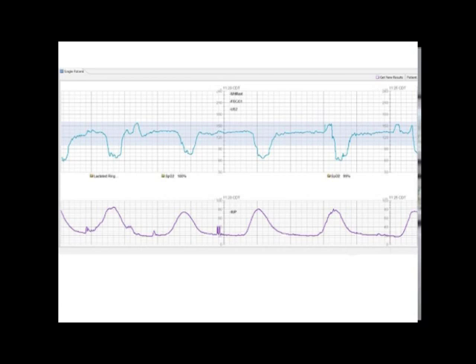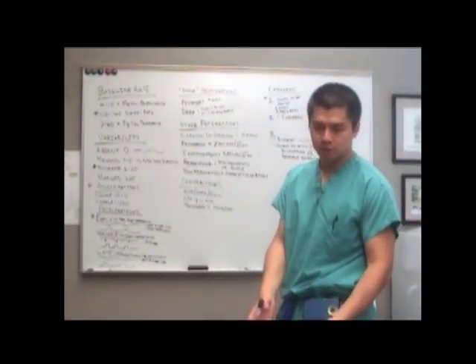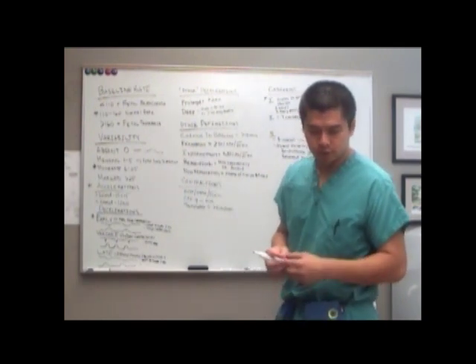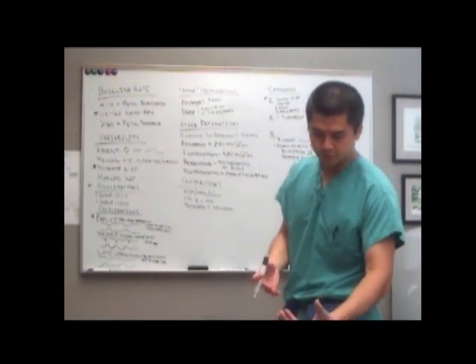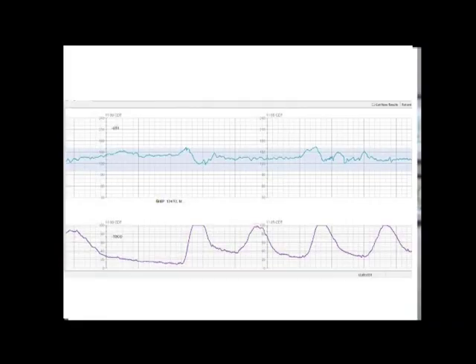Yep, they're recurrent because they occur with more than half of the contractions, at least that are on the screen. I know it's averaged over a 20-minute period and we only have about 10 to 12 minutes on the screen, but at least on what you see, they're recurrent. Or another way that you can describe them is that there have been X number of decelerations with the last X contractions. What about this fetal heart tracing?